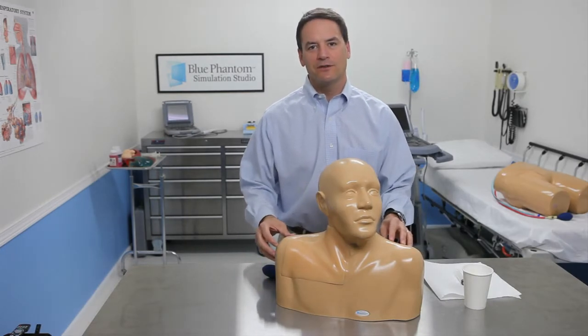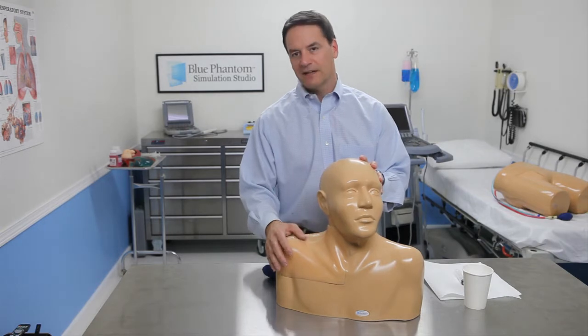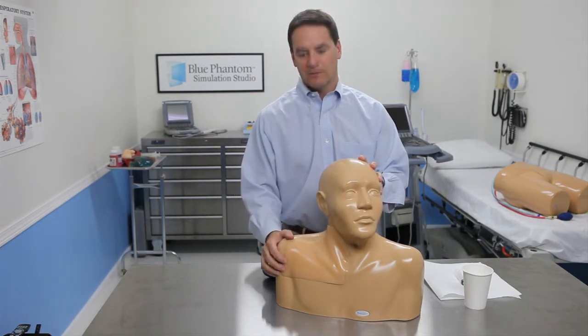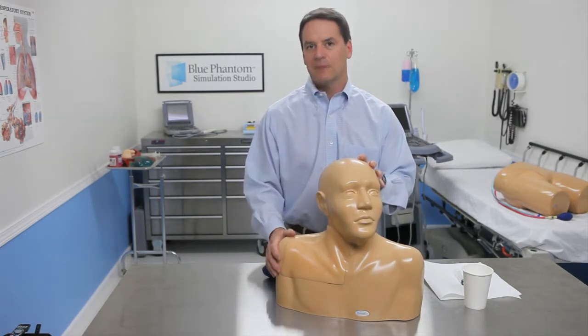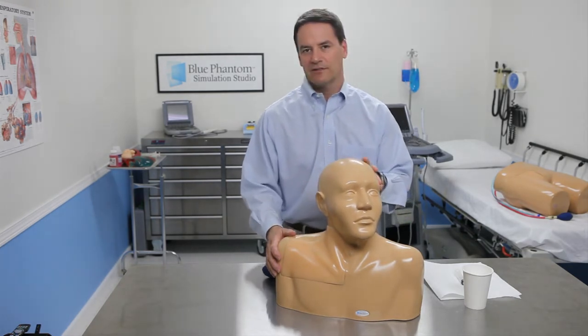Welcome to Blue Phantom Simulation Studios. Today, I'm going to show you how to remove the tissue inserts out of your training models and how to put them back in, so that if you need to take them out to refill them or replace them, it can be easily accomplished. It takes about two to five minutes to accomplish this task.